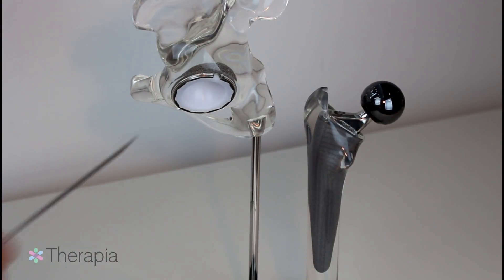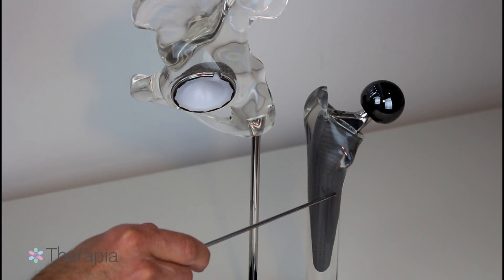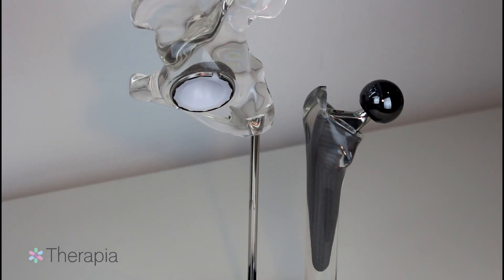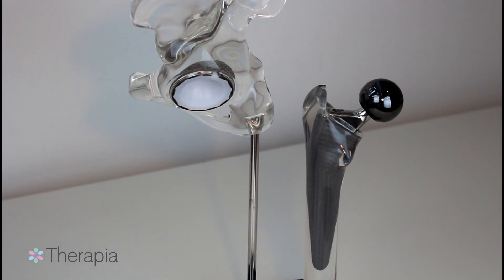Both of the implants on the acetabular side and the femoral side are fixed in place without cement. Over time, this technique relies on bone tissue ingrowth from the patient's body to stabilize the new components into place.